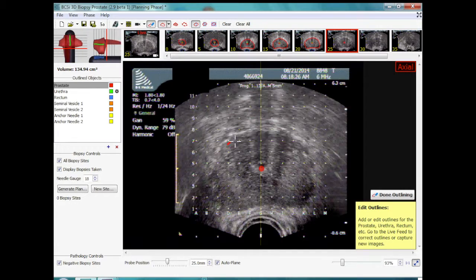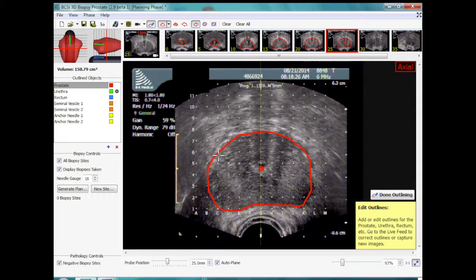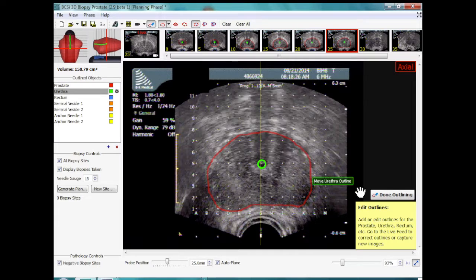This is a close-up view of the contouring. This is the sixth slice from base to apex being contoured. There are various options with the contouring tools allowing smooth or nodal contouring. You can always go back and adjust contours.